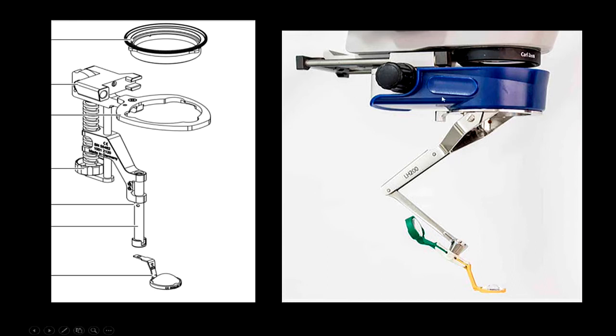While in a ReSight, the lens doesn't move up or down. You have the focusing system within the blue color adapter there. There you have the focusing lenses. So you have to move this knob here to get the focused image. So just the biome, how it is there.